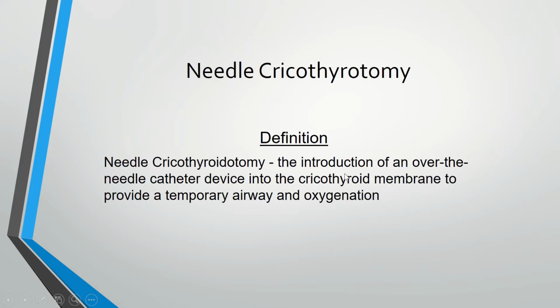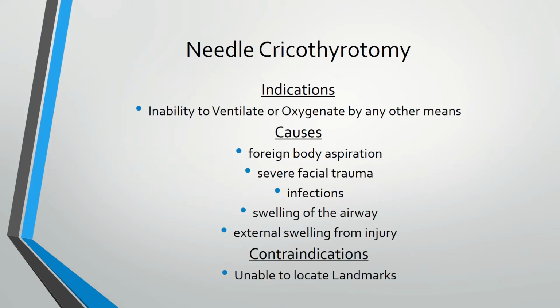So a simple definition of a needle cricothyrotomy is the introduction of an over-the-needle catheter device into the cricothyroid membrane to provide a temporary airway and oxygenation. That's the definition I found out of any paramedic book that you want to choose, and it's the definition you'll normally find for this procedure.